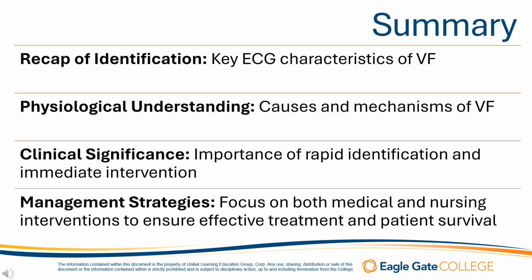Remember, defib for VFib. Defibrillation aims to restore a normal heart rhythm by delivering an electrical shock to the heart. While preparing for defibrillation, initiate CPR to maintain blood circulation and oxygenation. High-quality chest compressions and ventilations are critical for patient survival. Follow ACLS protocols, including the administration of emergency medications such as epinephrine or amiodarone.